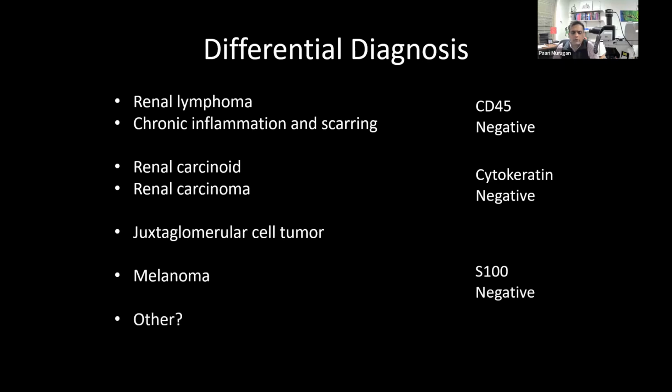Okay, so what other tumor could this be? Of course, we're discussing sarcomas. We need to think about sarcomas. So could this be some kind of an unusual sarcoma that's presenting in the kidney?